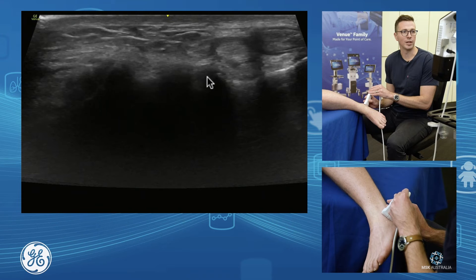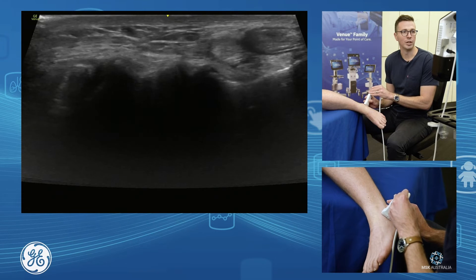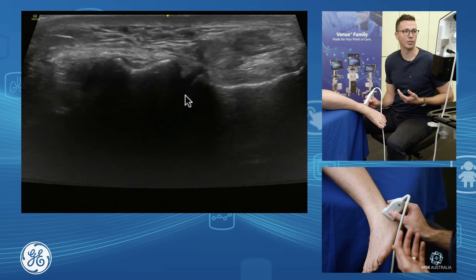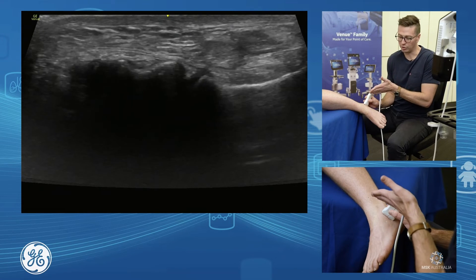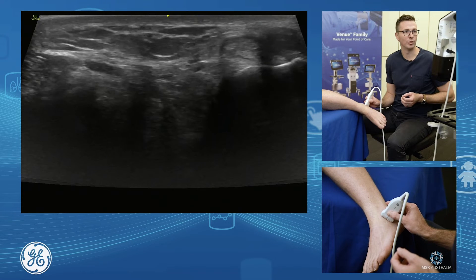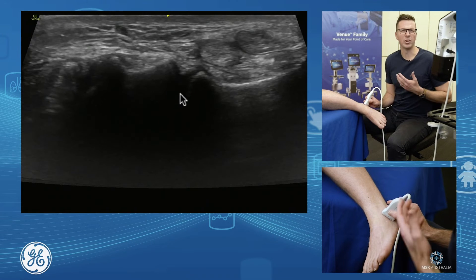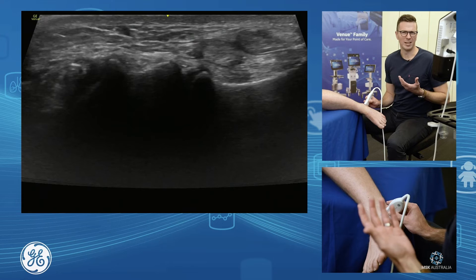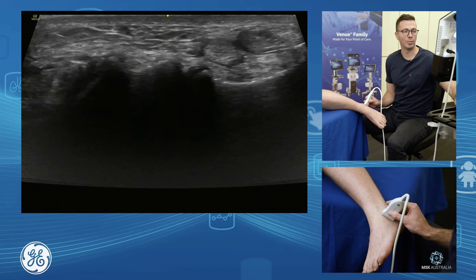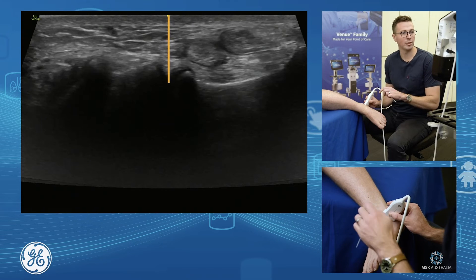This is the anterolateral aspect of our subtalar joint — our subtalar sinus tarsi injection out in through here. If we see our subtalar joint and drift the probe more towards the little toe, we come off into the sinus tarsi. This is a nice place to do an anterolateral subtalar joint injection. You can sit yourself up here, go short axis, and drop down and in.